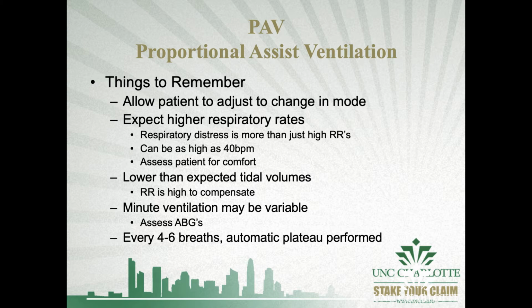Because we are delivering pressure to the lungs, we want to keep it at a certain plateau pressure to avoid any sort of barotrauma. All right. All in all, I wanted to introduce this mode of ventilation because it's kind of gaining steam. You guys might have a little bit more experience with this mode of ventilation. I personally am not a fan of it.